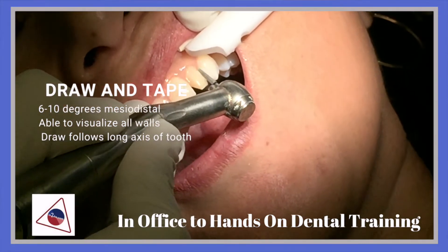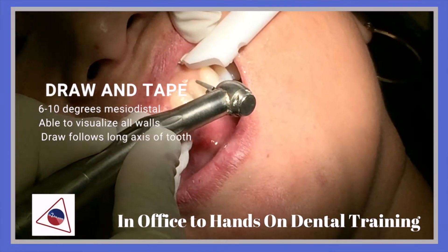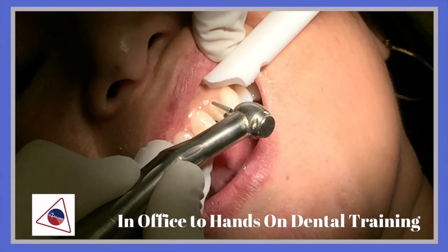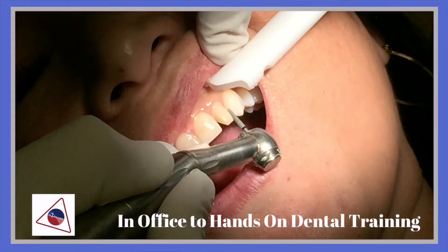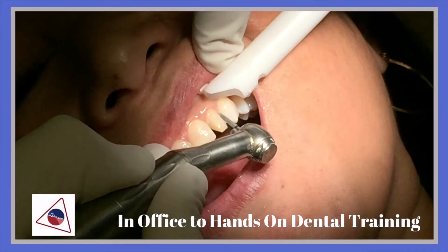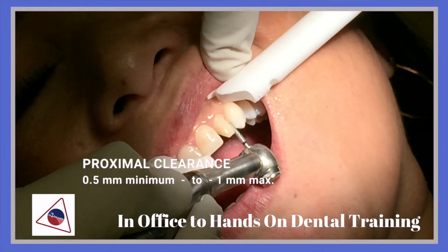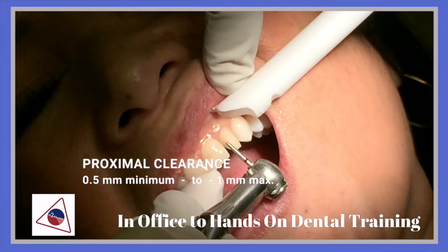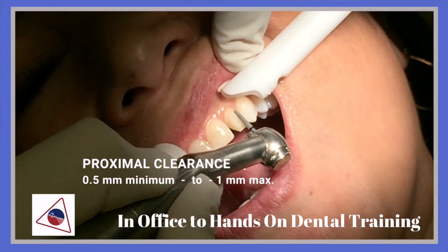The taper would be 6 to 10 degrees mesial-distal. Note the proximal clearance — we will be looking at a 0.5mm minimum to a maximum of 1mm.